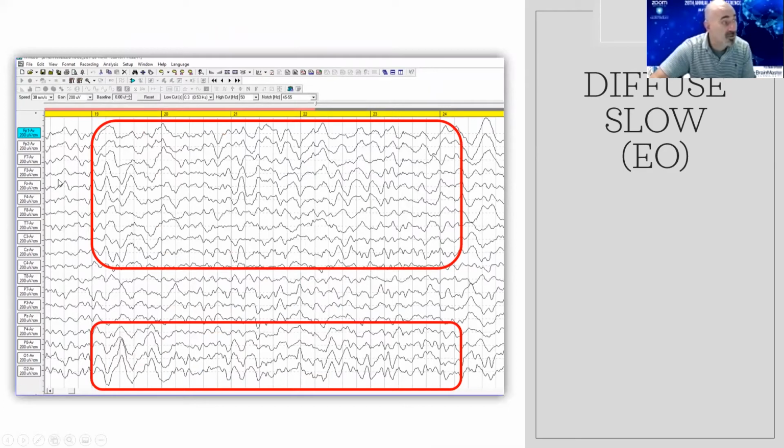And these don't generally persist, in this person's case, throughout the whole 10-minute recording. We see the EEG looks reasonably normal for good long runs, and then they have these events or transients where they let these big bursts go.